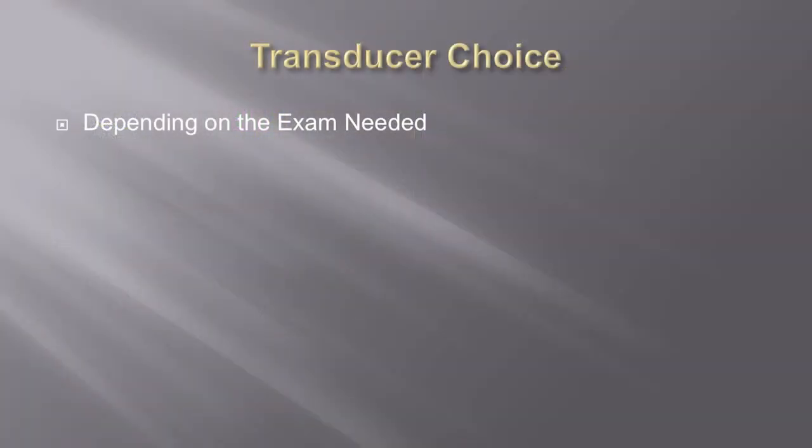So how do we choose a transducer? It's very simple. If you think about it, you have two types of runners: long-distance runners and sprinters. That makes sense? So what do we know about long-distance runners versus sprinters? Well, sprinters can go very short distances, very fast, and they're very good at it.